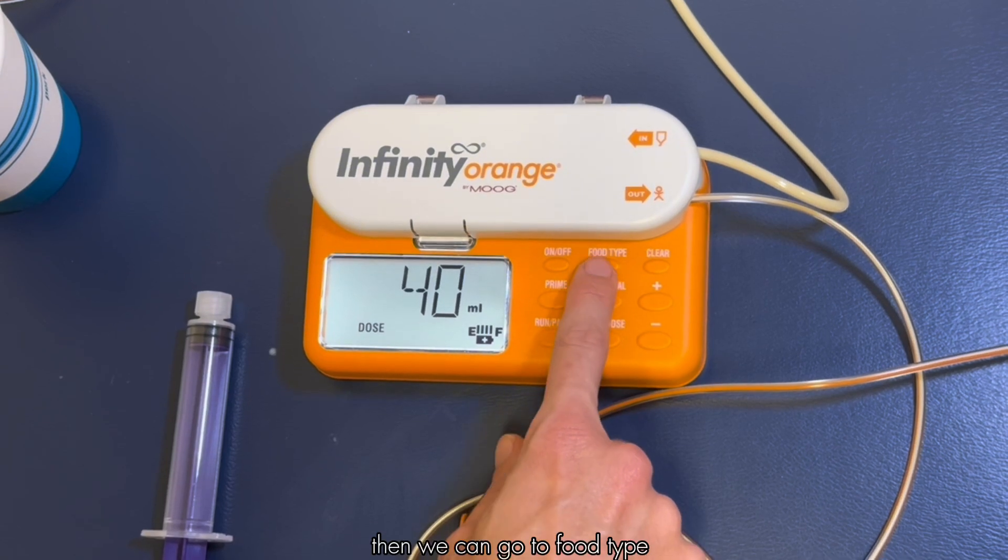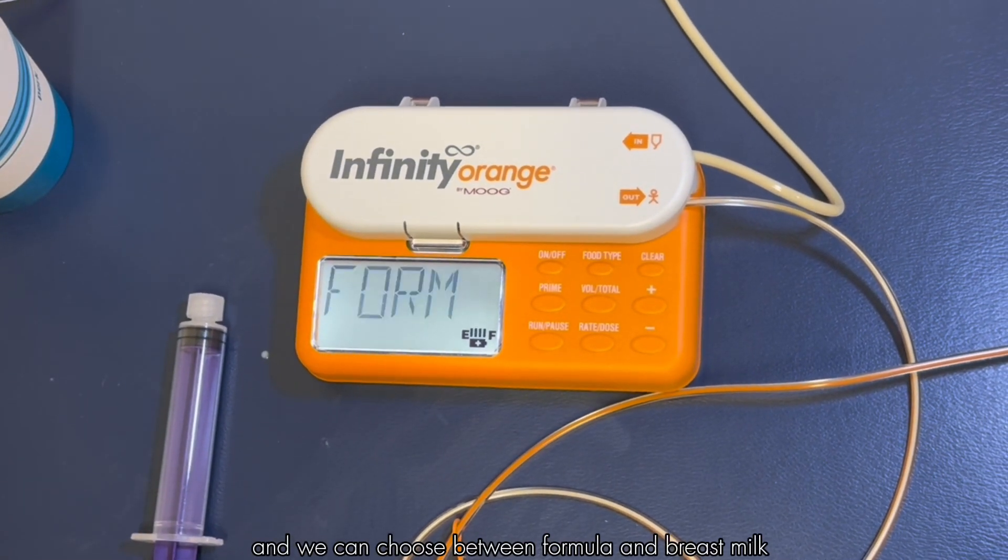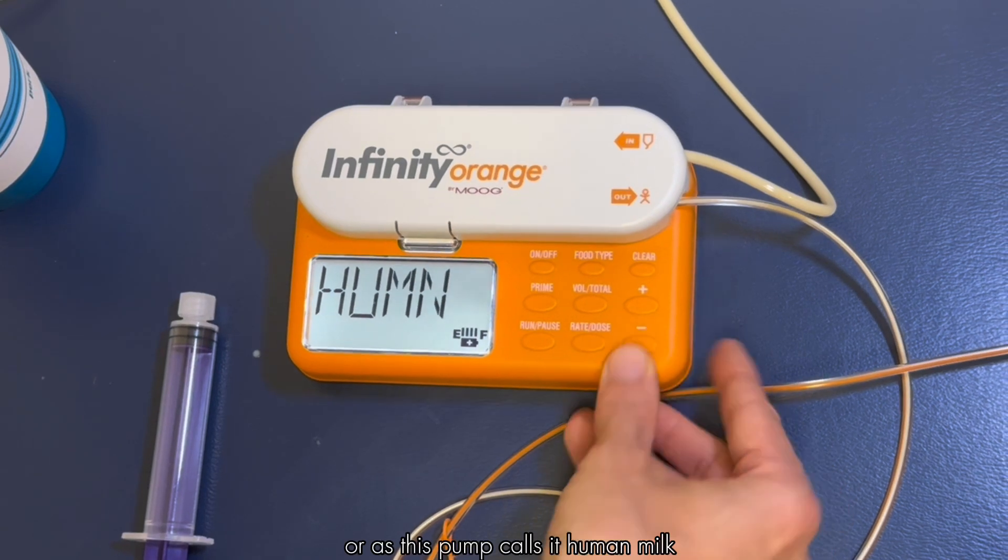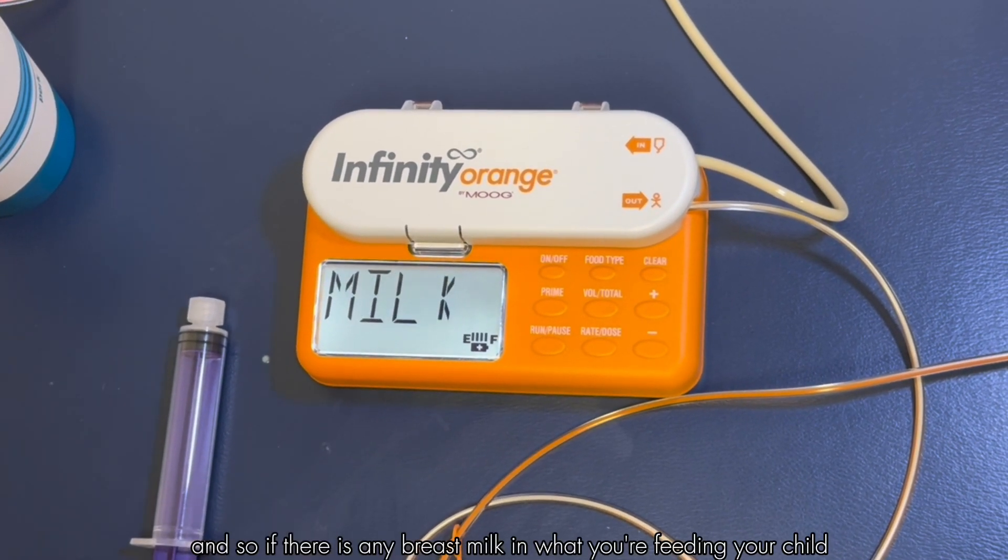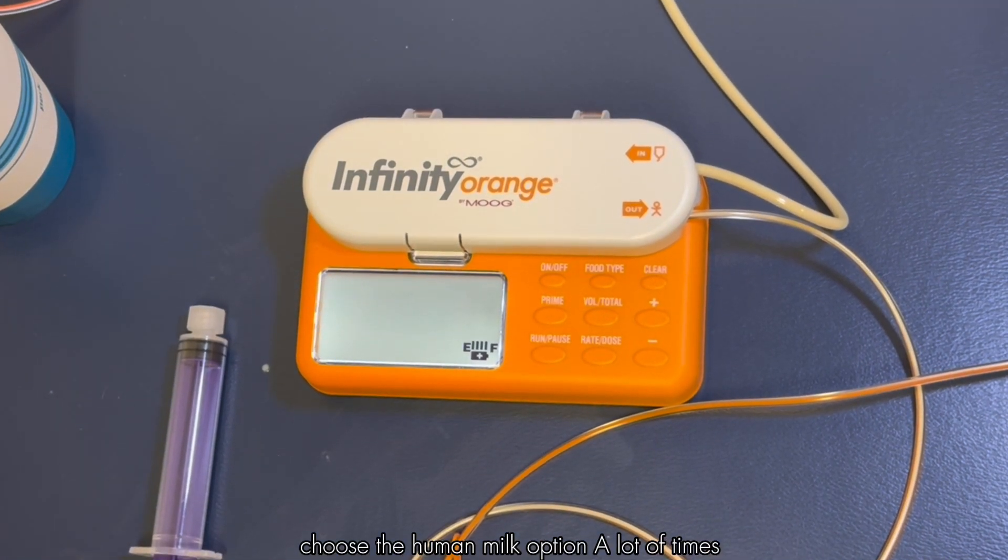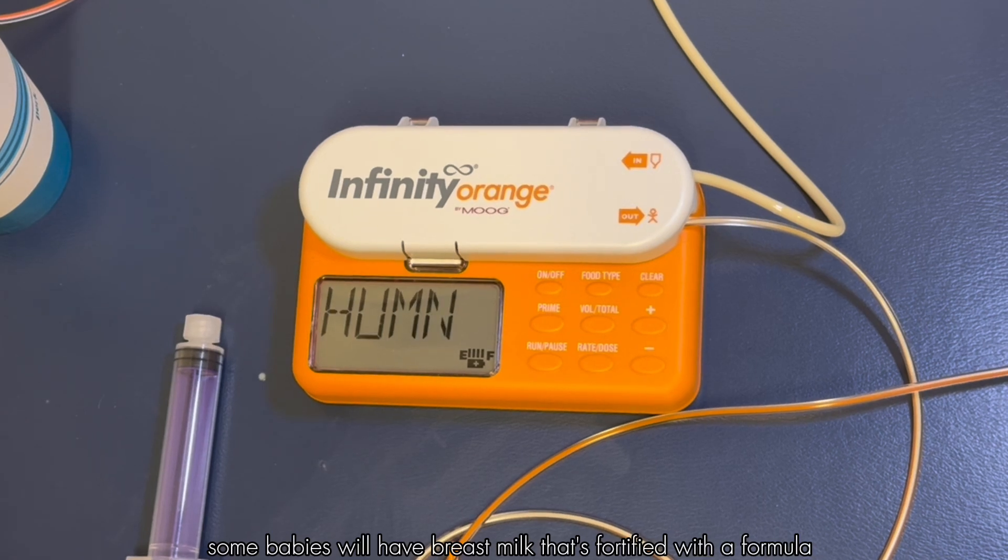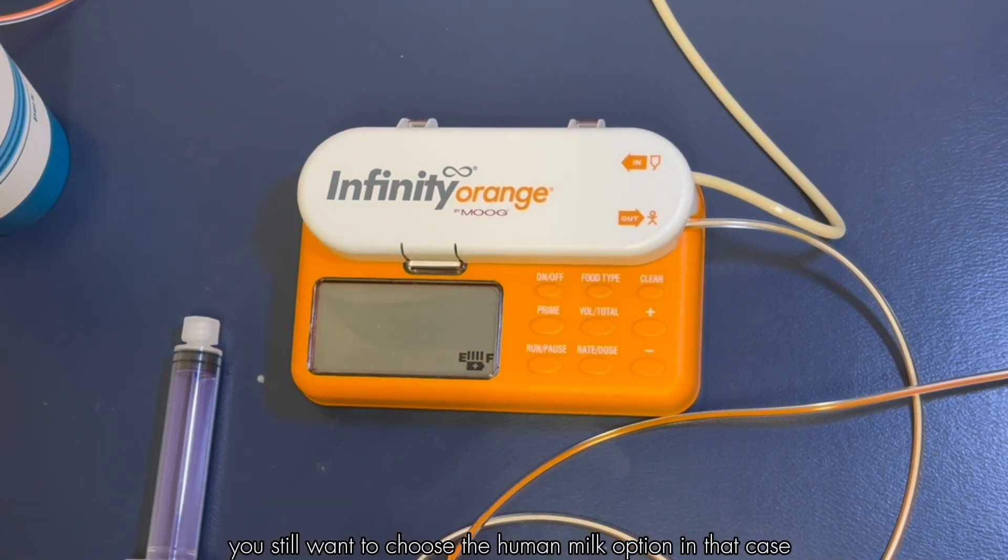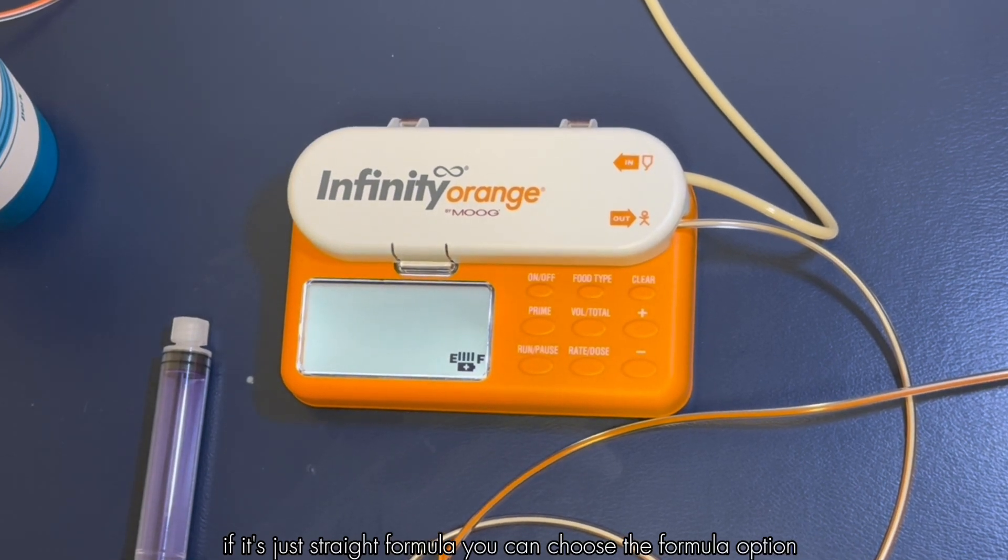Then we can go to food type. That's our top center button and we can choose between formula and breast milk or as this pump calls it human milk. If there is any breast milk in what you're feeding your child, choose the human milk option. A lot of times some babies will have breast milk that's fortified with a formula. You still want to choose the human milk option in that case. If it's just straight formula you can choose the formula option.